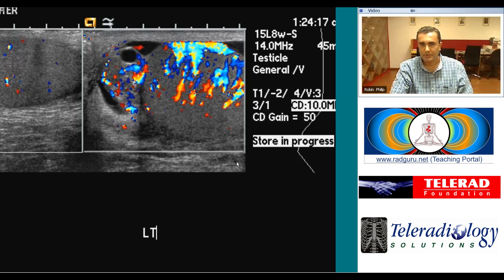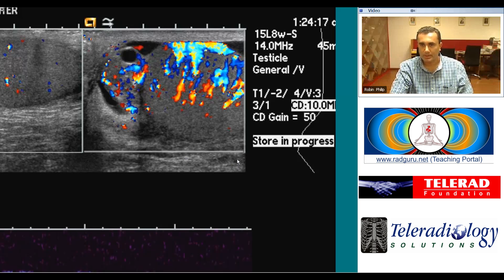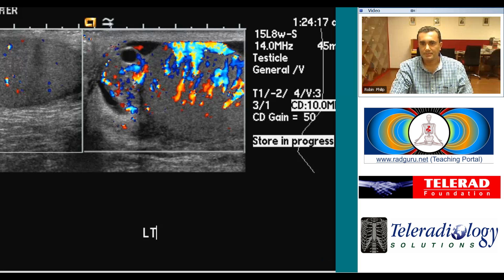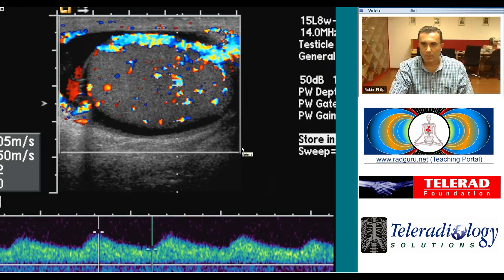In the setting of a hyperemic and hypervascular testicle and epididymis, thank you.